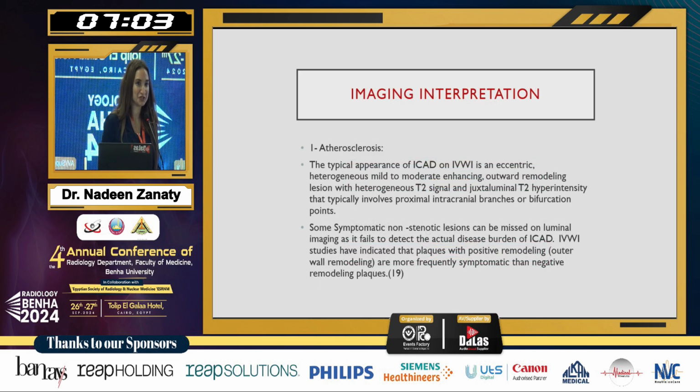So we talked much about atherosclerosis. When I see the images, how can I interpret them, what's important to see? Well, what characterizes the atherosclerotic plaque is that it's eccentric. It means that it takes a focal segment of the vessel wall itself. It's not symmetrical. And I would like to check the T2 weighted image, because the T2 will show me the different composition of the plaque. The plaque contains calcium, hemorrhage, the lipid-rich core, and the fibrous cap.